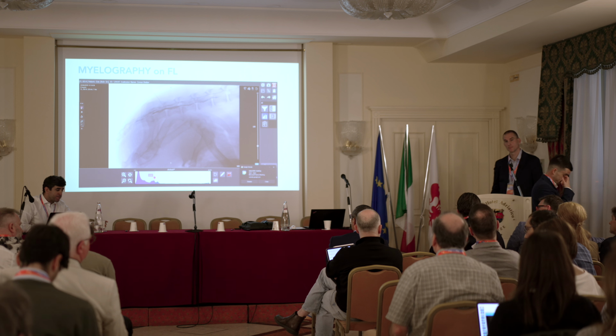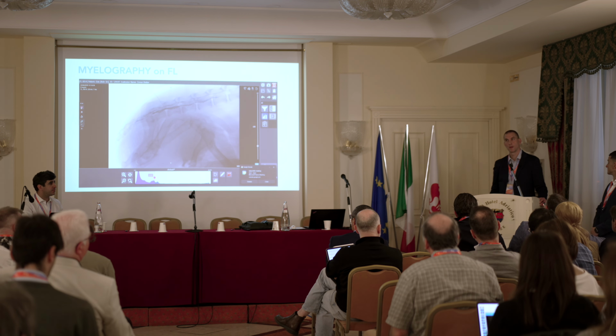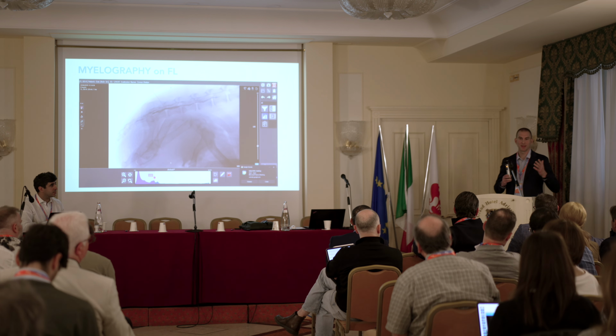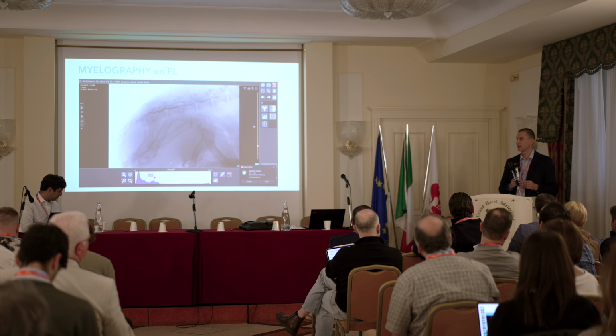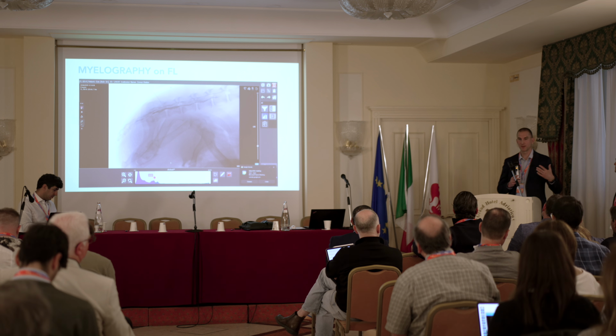Do you think that surgical navigation can help in the needle positioning? It could, but I think this tool is quite big for that application. So if you have it, you can use it, but for those cases, I had to train a lot before I started on live animals.